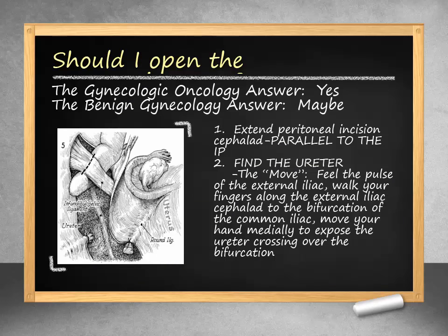We now have easy access to the retroperitoneum. Entry into the retroperitoneum allows easy identification of the ureter as well as access to the pelvic lymph nodes. Thus, it is almost always done in cases of pelvic malignancy. In the benign setting, surgeons may opt not to open the retroperitoneum. After incising the round ligament, the peritoneum is further incised parallel to the infundibulopelvic ligament and extended cephalad.